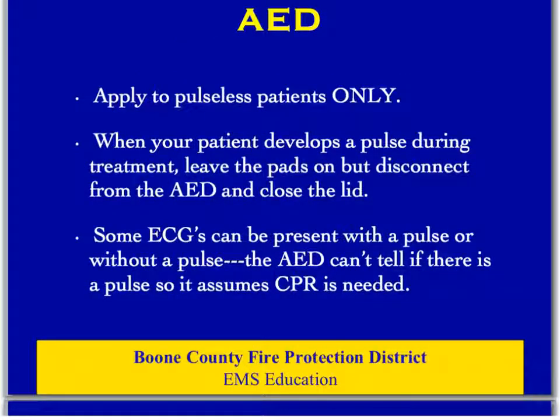Switching now for a second to talk about AEDs, we should apply them only to pulseless patients. If you're not certain, start CPR and apply the AED until you can be certain. But once your patient develops a pulse during treatment, he may lose a pulse again, and so you don't want to take the pads off, but you need to disconnect those pads from that AED, or the AED will continue to prompt you to do CPR anytime it sees a rhythm that's not VFib.